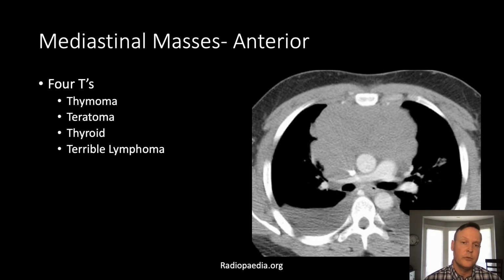And often for an anterior mediastinal lesion, you'll have to go on to MR to further characterize it, especially if it's a smaller lesion with just soft tissue density on CT. There are other malignancies to consider if they are in a different distribution of the mediastinum, such as the middle or posterior. For instance, if you had a posterior malignancy, you may be thinking about lymphoma versus a neurogenic tumor.